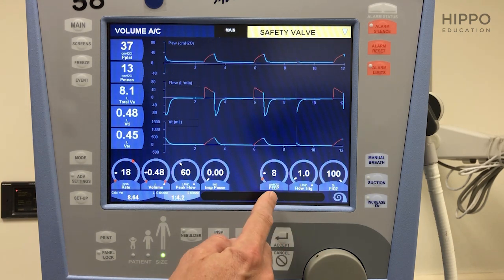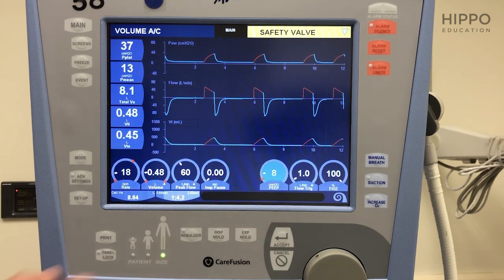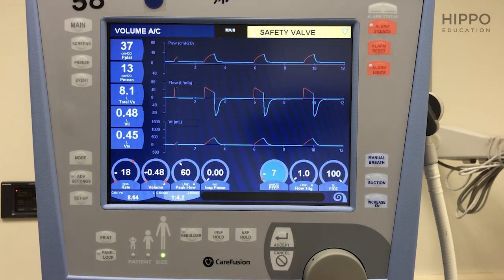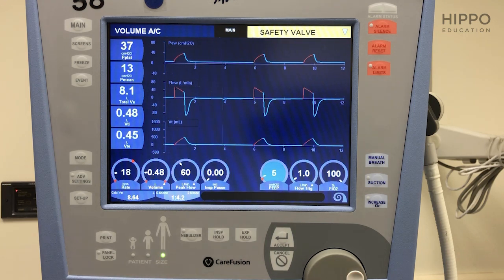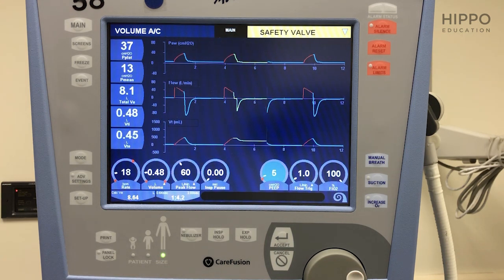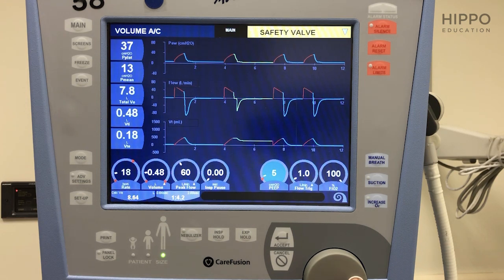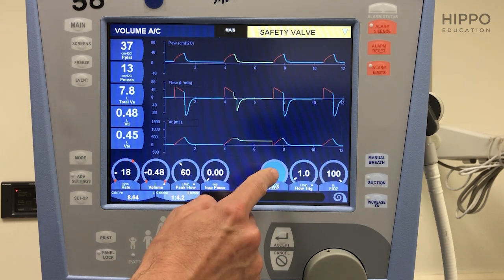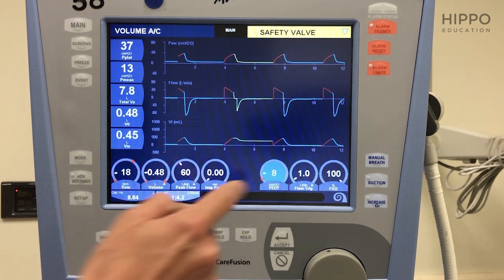Let's move on to PEEP. This PEEP here is set at 8. Remember, the lowest for the ARDSNet protocol is 5, and you're going to be moving that up based on your oxygenation requirements. For COVID, we're going to set that starting at about 8. Accept.